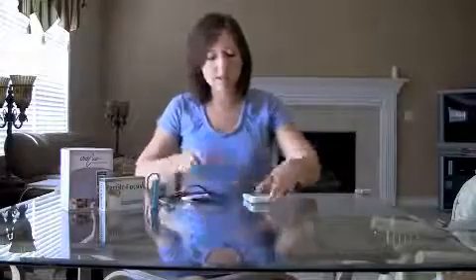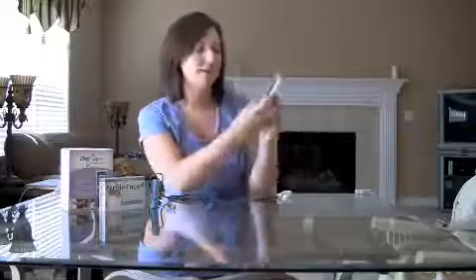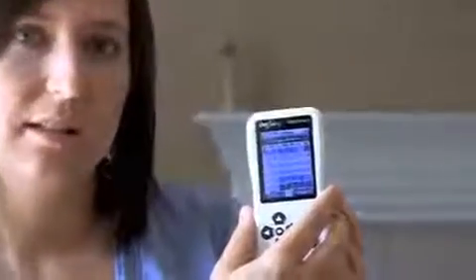Once you take your readings, you turn the monitor on and plug it in. On your day, it gives you a calendar where you choose either an oral sensor or a vaginal sensor. After you do that, there's a menu button where you can select readings and view all your readings. It tells you the date, your cycle day, and your oral and vaginal readings.